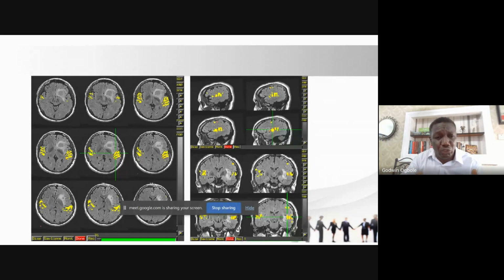If you look at this image, you will see two side by side, asking a person to perform a particular task. You can see one area is being affected more by the tumor, which in this case is on the right-hand side. So functional MRI, using these color-coded techniques, can show us if the tumor will affect functionality, such as speech or movement, and how you can do what is called sparing, to prevent damage or retain certain functions in a person that has a tumor you want to do surgery for.